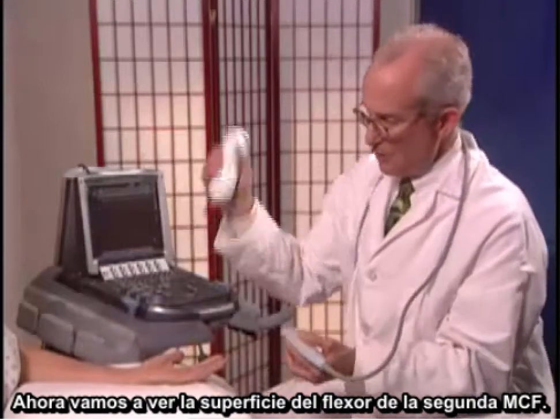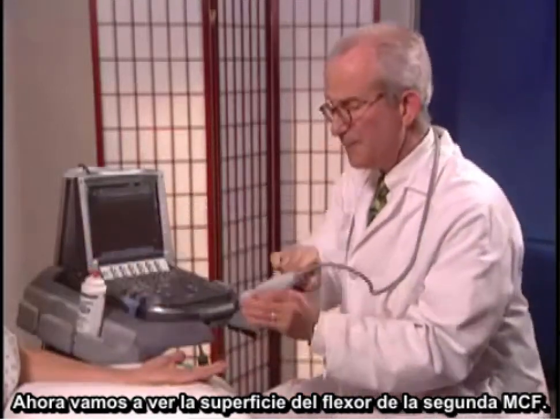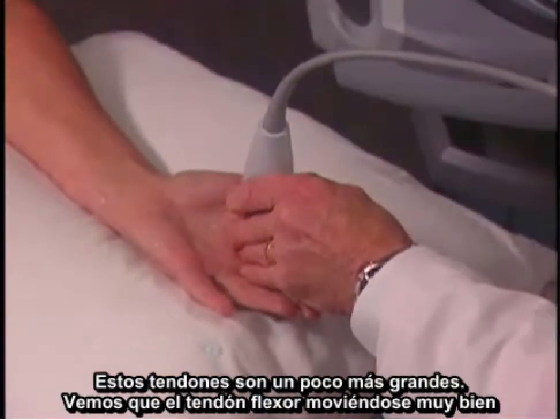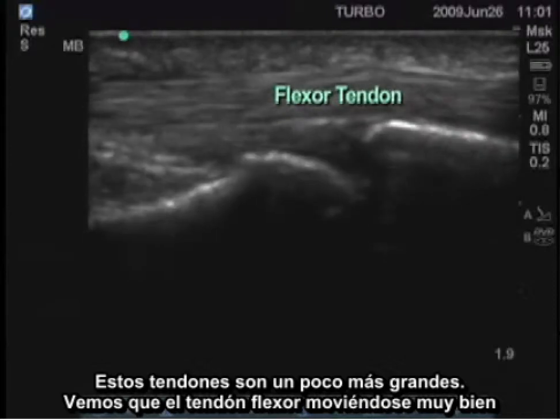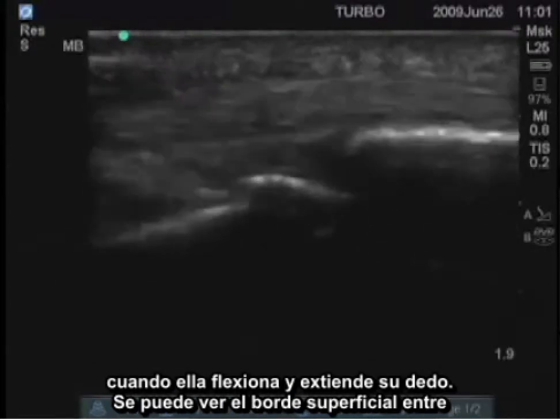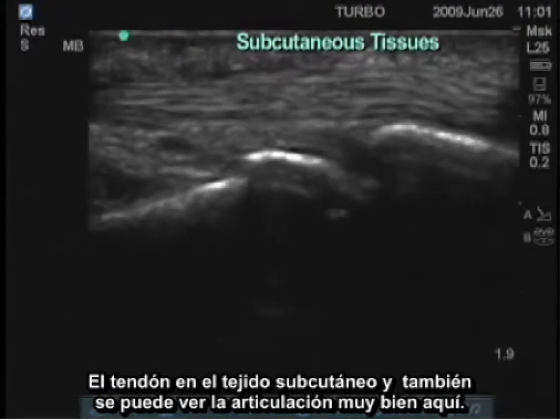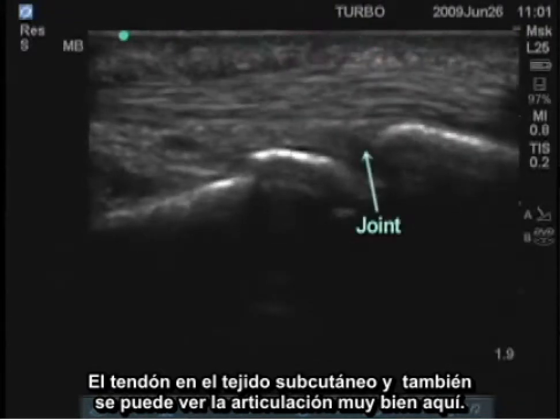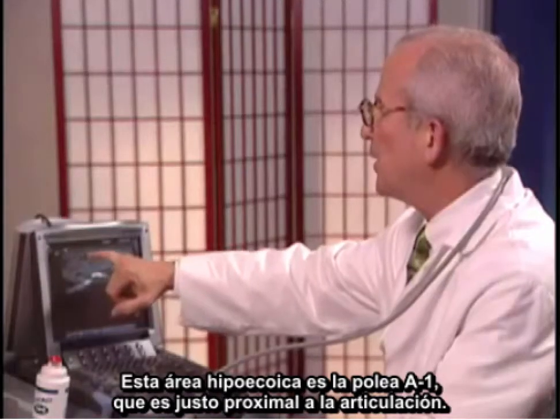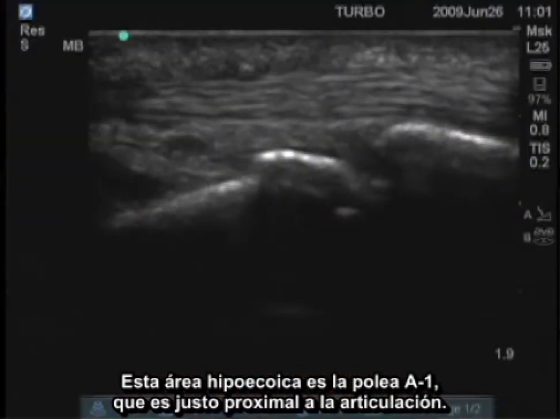We'll look at the flexor surface of the second MCP. These tendons are quite a bit bigger. We see the flexor tendon moving very nicely as she flexes and extends her finger. You can see the superficial border between the tendon and the subcutaneous tissues, and you can see the joint very nicely here. This hypoechoic area is the A1 pulley, which is just proximal to this joint.